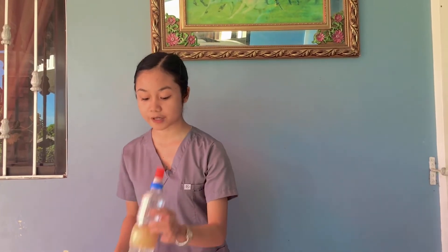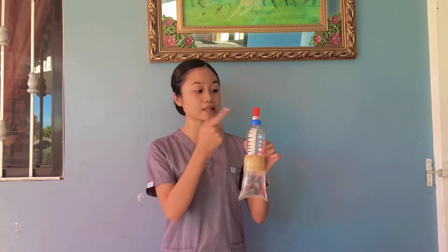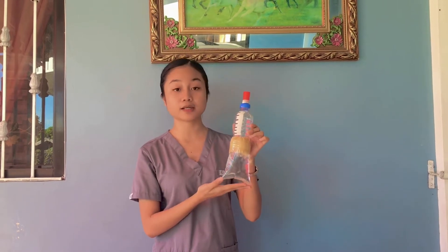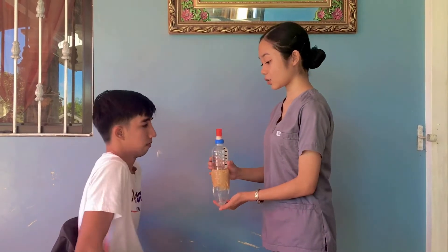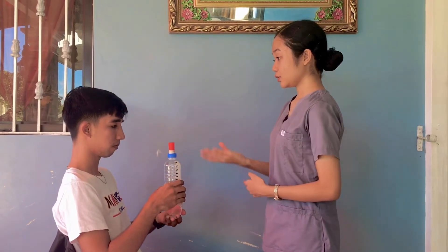What we have here is an improvised incentive spirometer. This is the mouthpiece, this is the main chamber, and the indicator here will serve as the piston. First, advise the patient to position themselves appropriately — sir, you have to sit erect and hold the spirometer correctly.